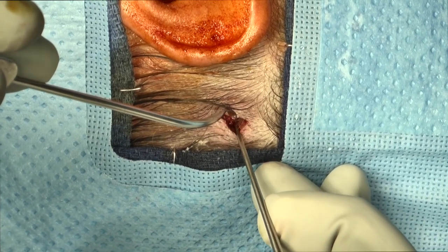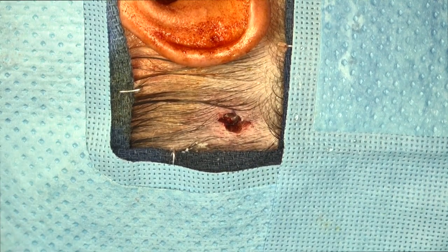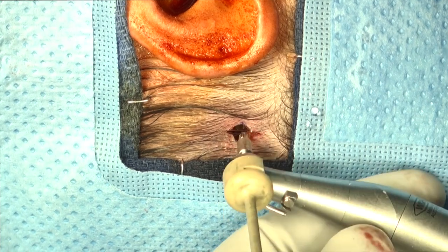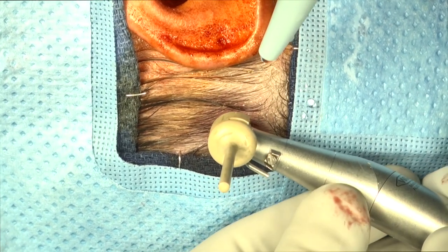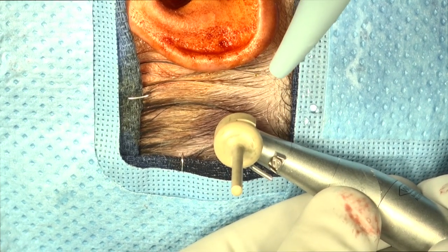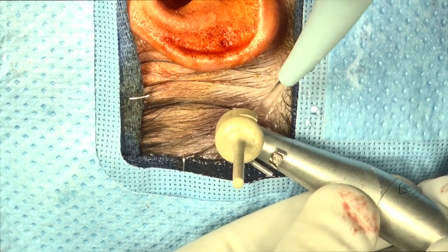If there is exposed dura after using the 3 millimeter drill, generally a 3 millimeter osteo-integrated screw is placed. If there is solid bone at the depth, we then proceed with a 4 millimeter length screw. If there is no exposed dura, the white spacer should be removed and the hole extended to a depth of 4 millimeters, again at 2,000 RPM with constant irrigation.